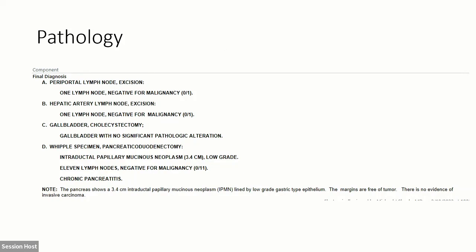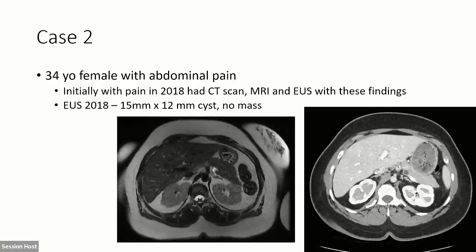Patient did really great. She was out of the hospital in probably 5 or 6 days and is doing really well in her follow-up. And clearly that change in the cyst itself was probably leading to chronic pancreatitis. She had a large stone in the head of the pancreas as well, so they saw chronic pancreatitis changes with that. So the ultrasound was helpful both in just defining the normal anatomy, and was helpful in making sure I was really pulling that uncinate process over towards me and really seeing all of that cyst get removed.